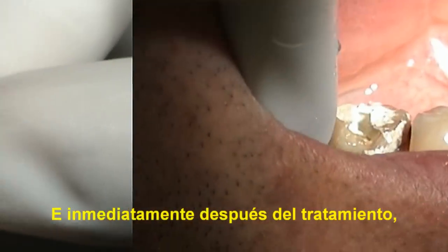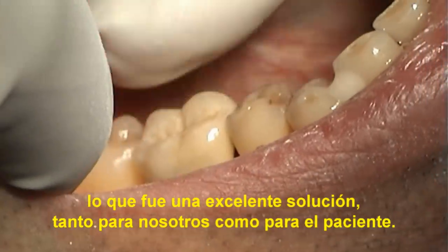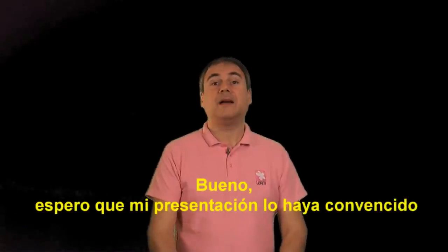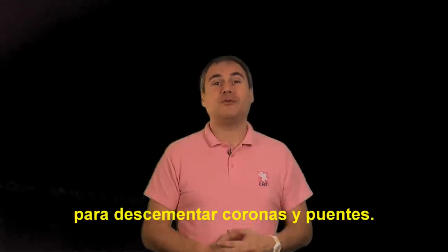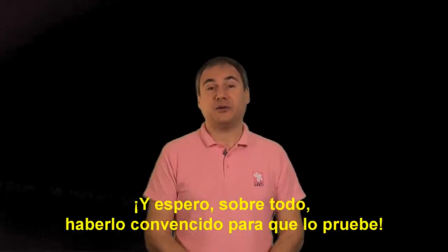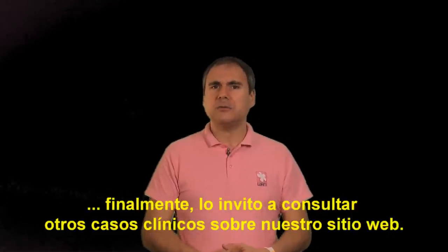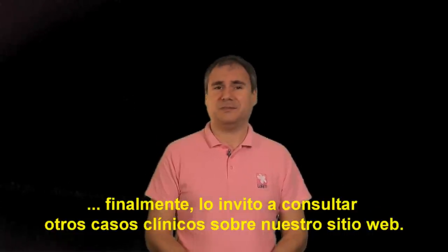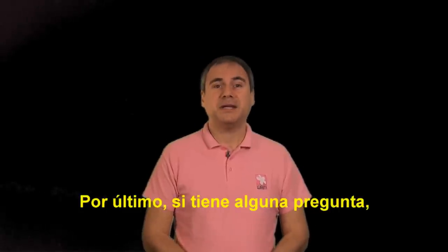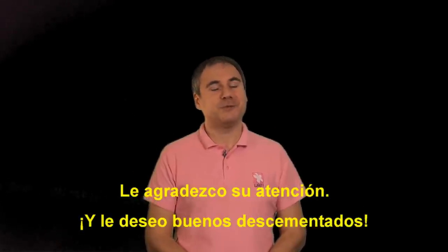Right after the treatment we were able to reuse the crown and re-cement it permanently, which was an excellent compromise for us and for the patient. I hope my presentation convinced you that One Key is presently the best solution for removing crowns and bridges. If you need more arguments, I recommend watching our clinical cases on the website. If you have any questions, please feel free to contact us. Thank you very much for your attention, and have nice crown and bridge removals!